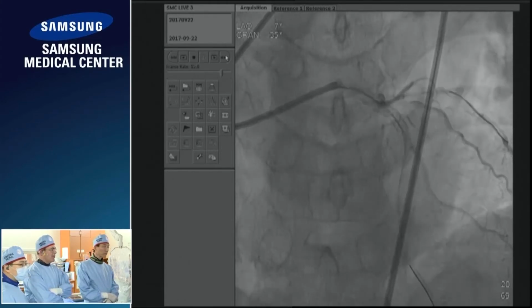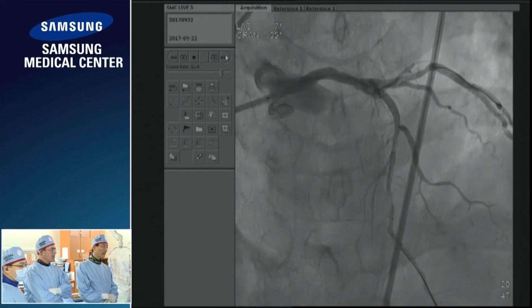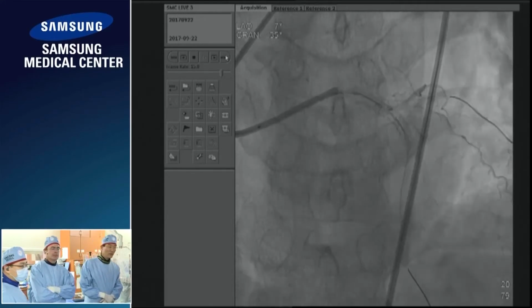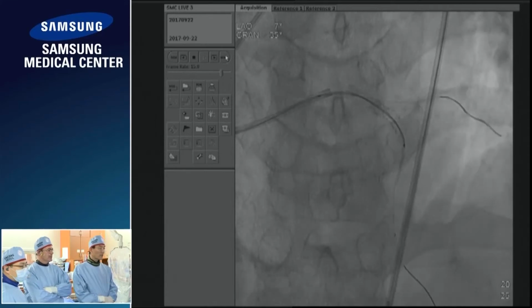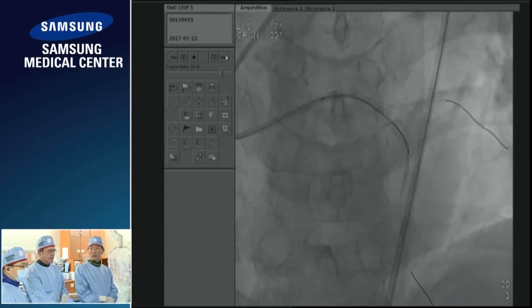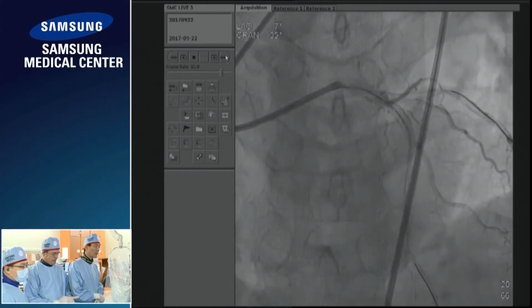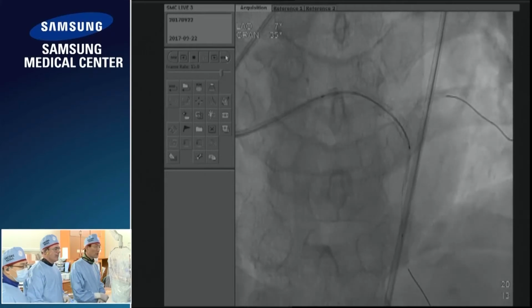The proximal bit of the left main is 5.5. The problem is that just above the diagonal, the second diagonal, the vessel size is more than 3, but the lumen size is about 2. Actually, to avoid the dissection and implant a large stent is challenging. So next.